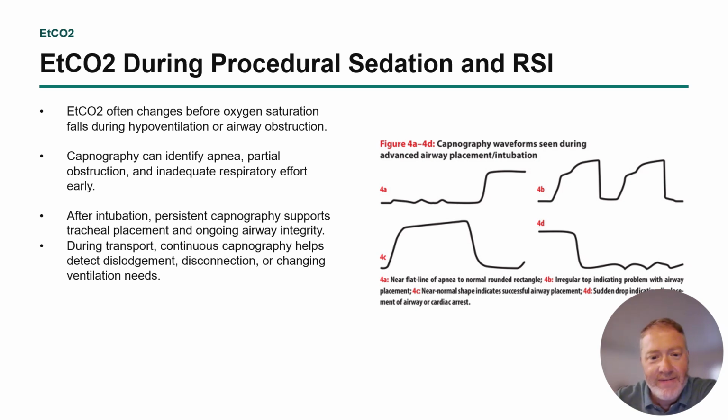If you have the option to put an end tidal on during your procedural sedation and rapid sequence intubation, then do it because it can help to identify apnea, partial obstructions, inadequate respiratory efforts early, sometimes even before you can visually see it with the patient.